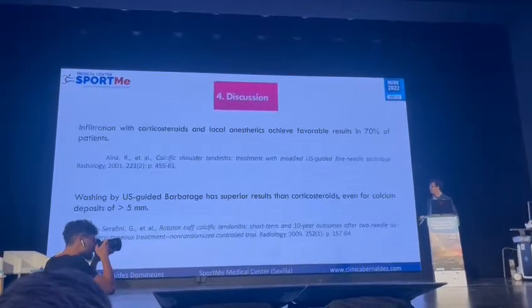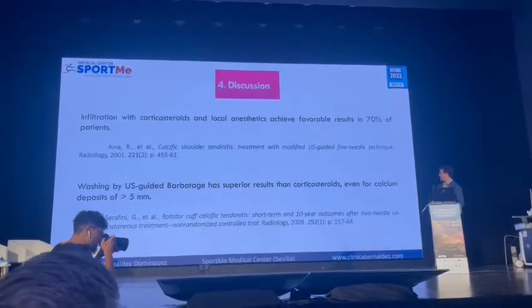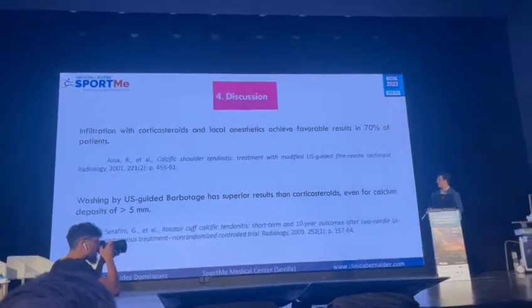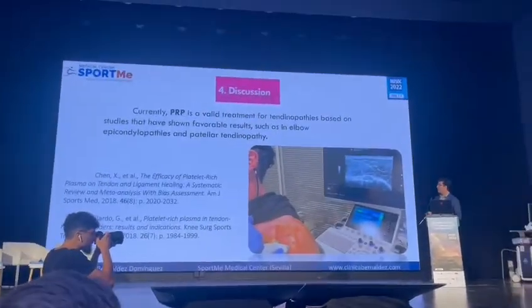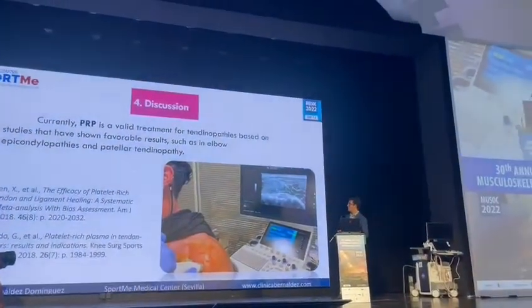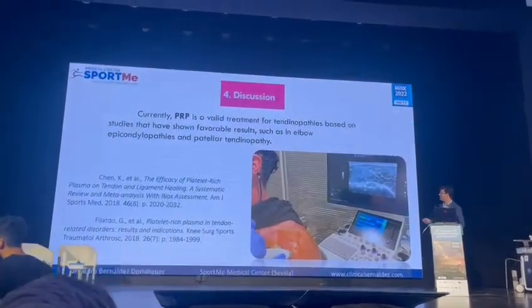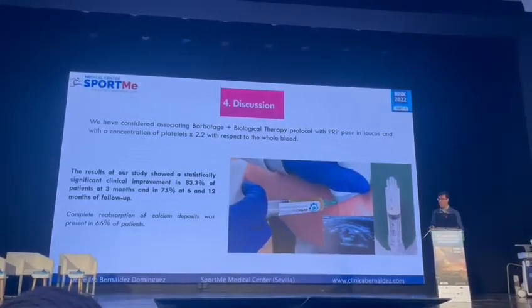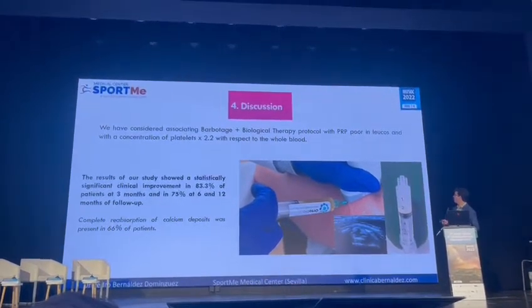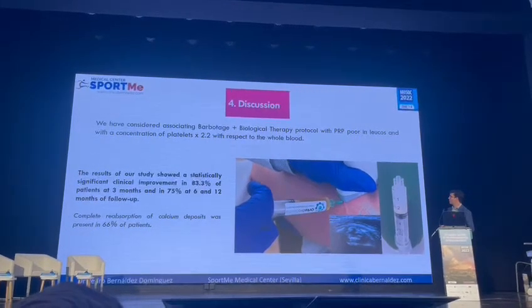Okay, in the discussion, we can say that washing by ultrasound-guided barbotage has superior results to corticosteroids, even for a calcium deposit of more than 5 millimeters. Currently, PRP is a valid treatment for tendinopathies based on studies that have shown favorable results, such as in epicondylopathies and patellar tendinopathy. We have considered associating barbotage with a biological therapy protocol with PRP poor in leukocytes and with a platelet concentration of 2.2 with respect to whole blood.